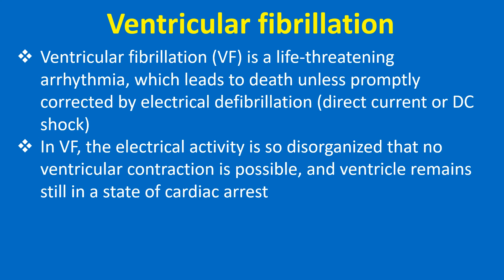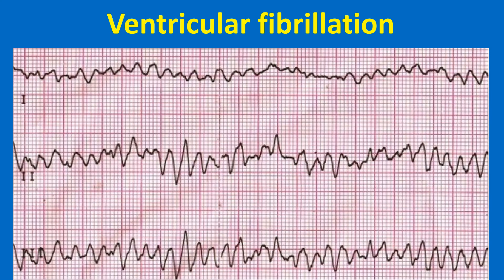Ventricular fibrillation is a life-threatening arrhythmia which leads to death unless promptly corrected by electrical defibrillation — direct current or DC shock. In VF, the electrical activity is so disorganized that no ventricular contraction is possible and the ventricle remains in a standstill state of cardiac arrest. Ventricular fibrillation is recognized on the ECG as highly disorganized electrical activity where each wave has a different morphology. When multiple simultaneous leads are available, the morphology differs between leads as well. Here it is a coarse ventricular fibrillation.